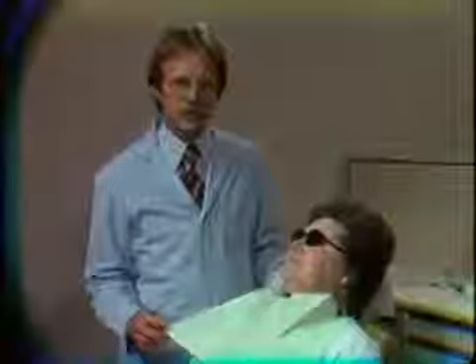The patient is able to make all the excursions without feeling the removable partial denture in position. This is necessary because if there is a high spot, it would be reflected in the functionally generated path, and we don't want this to occur.